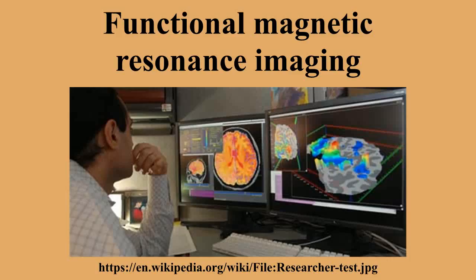Matching neural activity to the BOLD signal. Researchers have checked the BOLD signal against both signals from implanted electrodes and signals of field potentials from EEG and MEG. The local field potential, which includes both post-neuron synaptic activity and internal neuron processing, better predicts the BOLD signal, so the BOLD contrast reflects mainly the inputs to a neuron and the neuron's integrative processing within its body, and less the output firing of neurons.